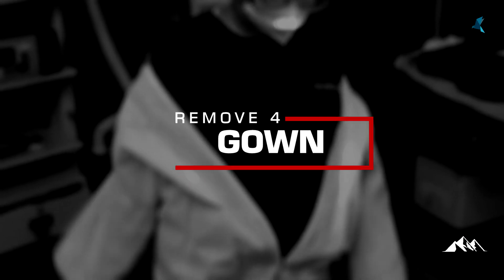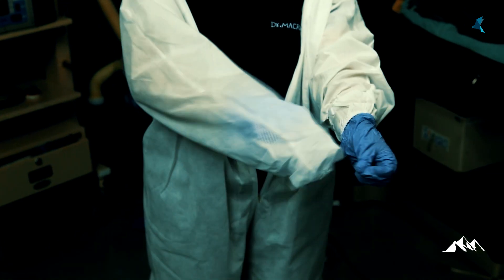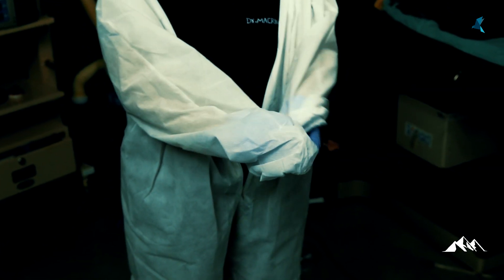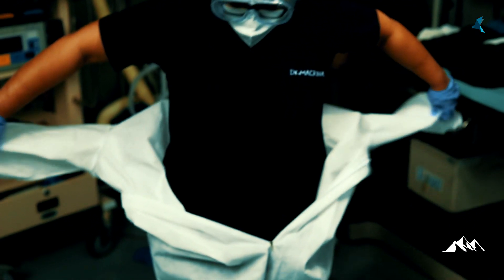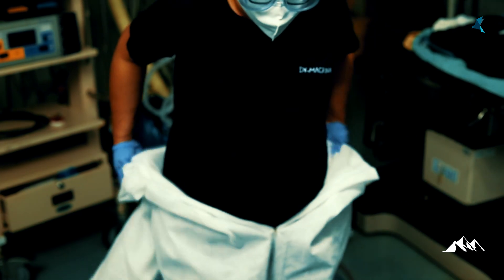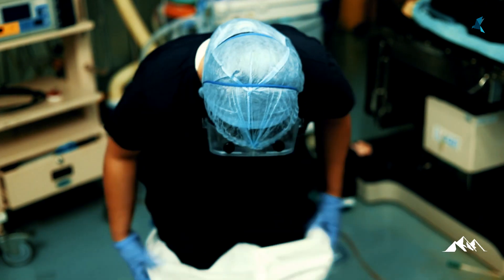Step 4: removing the gown. Carefully take out the sleeves and pull the hands inside. Now with the help of hands, slowly pull the gown downwards. Once it has reached the waist level, hands can be taken out by everting the sleeves. Now push the gown down, roll it inside out, and finally take it off the legs.